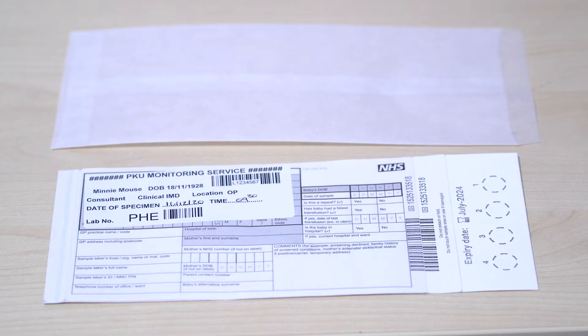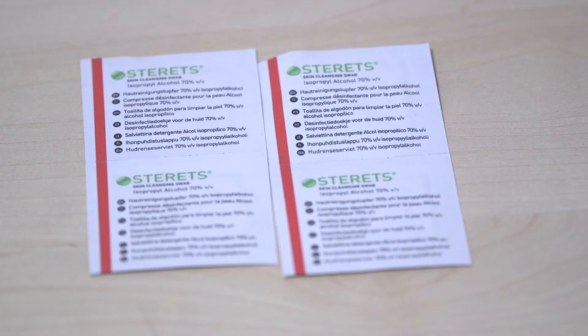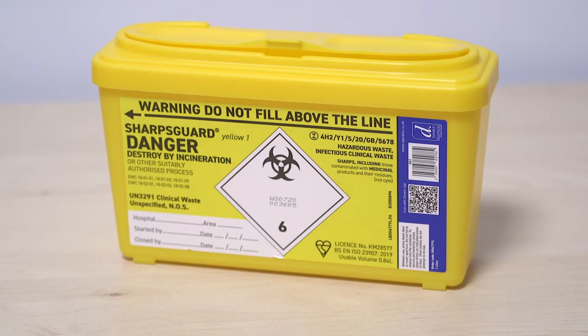The blood spot card is labelled, the clear envelope it goes into, a self-addressed stamped envelope, alcohol wipe, cotton wool and plaster if needed, and a sharps bin.